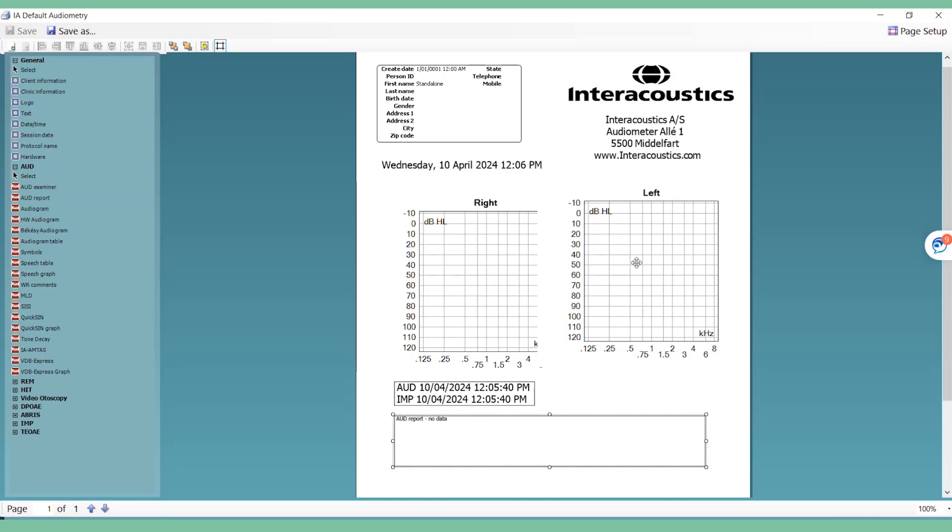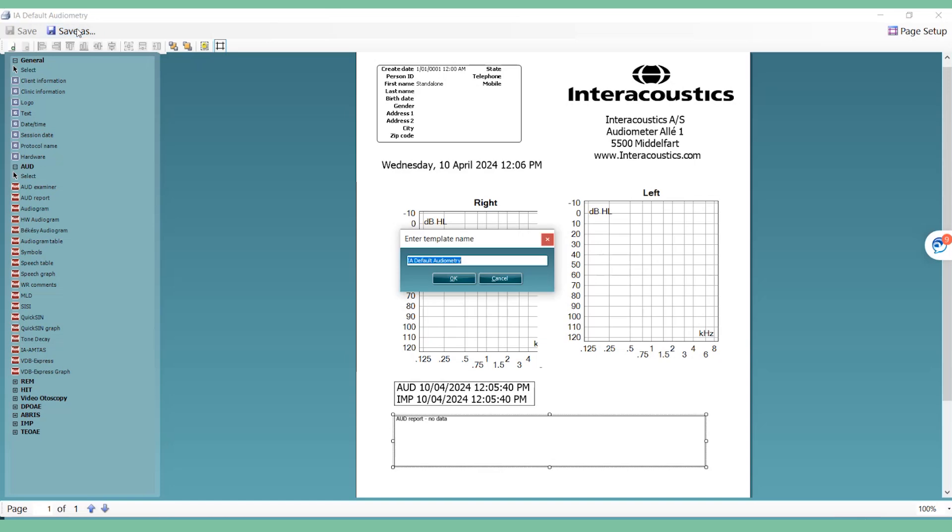You can refer to the manual for full instructions on report-making templates. Once you're happy with your design and layout, click Save As and name it accordingly.